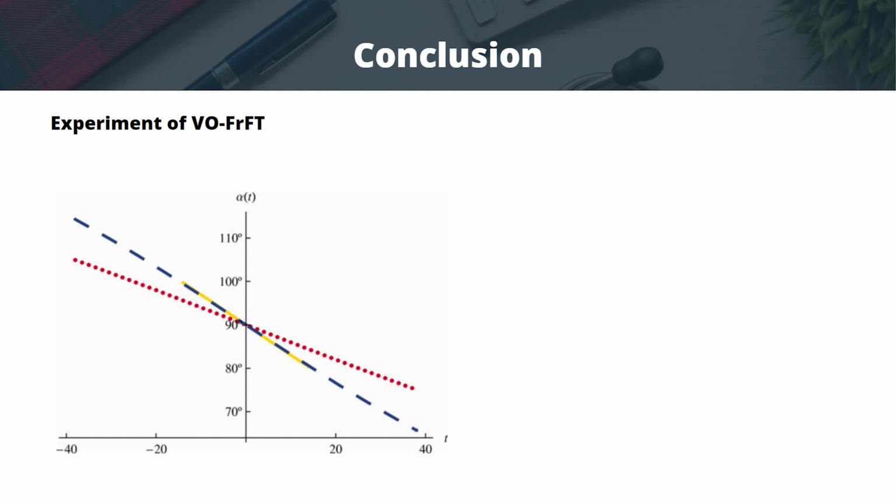Numerical experiments show that the VOFRT can effectively reconstruct the MR signal under a simulated quadratic field, correcting geometry and intensity distortions better than FG and CP reconstruction. Experiments in an actual MR system show that under a nearly quadratic field, our method is able to approximately reconstruct the image and correct some of its geometric distortion, improving over the FG reconstruction but not exceeding the CP correction, which takes into account not only the second-order component but also the exact measured field.